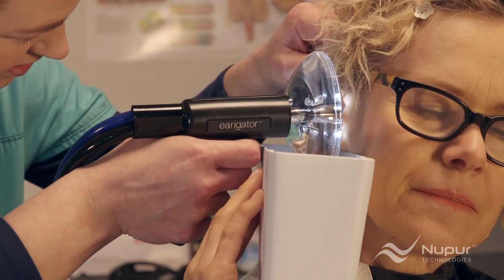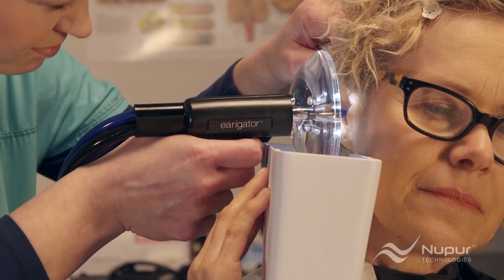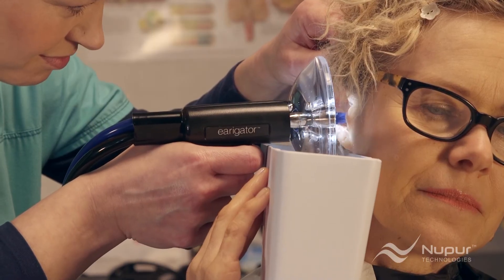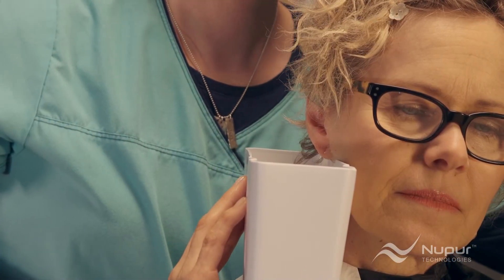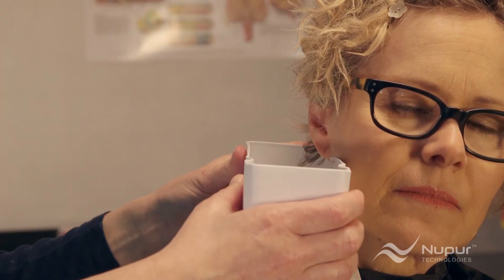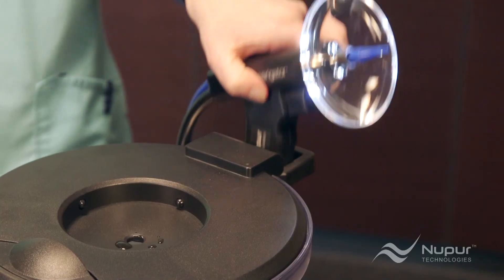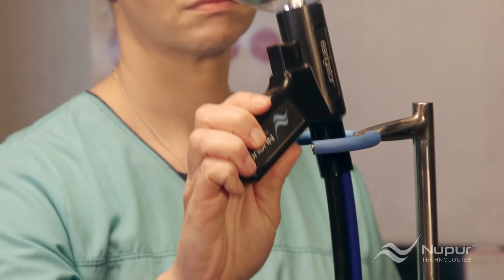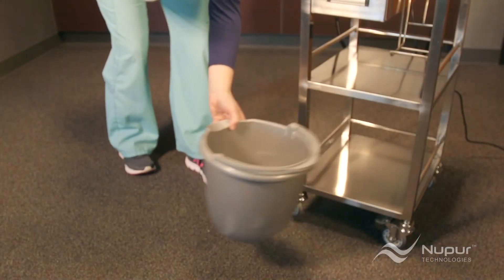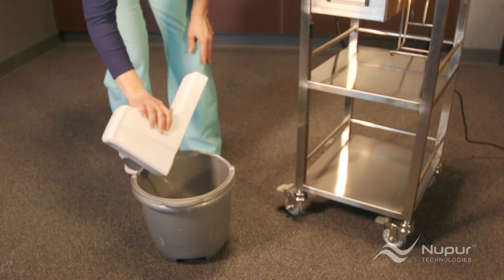Rachel will continue with full flow for 10 to 20 seconds, periodically monitoring the water and earwax in the catch basin. Once she sees substantial earwax in the catch basin, or that the water level in the basin is nearing the top of the deep well, she will stop to empty it. Rachel places the handpiece either in the irrigator lens holder or the cart lens holder while emptying the water. If you don't have a sink or toilet nearby to empty the basin, don't worry — you can use a bucket.